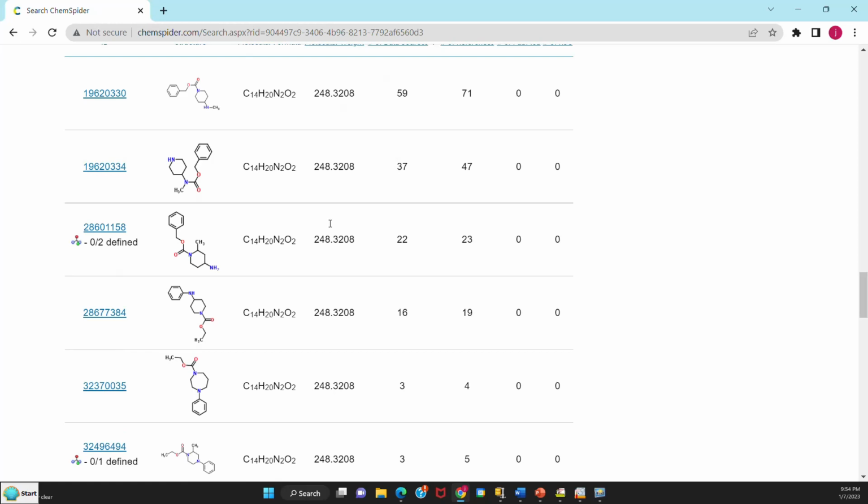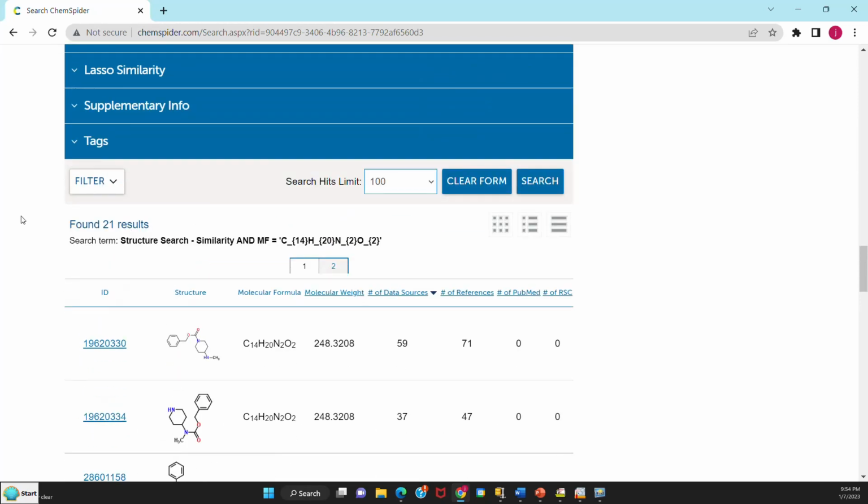So that's pretty much the end of my ChemSpider demonstration. And the main thing I need to say is you got to make sure that the right values get entered, make sure they're checked properly. Sometimes you need to toggle that window open and close to make sure the values entered properly. See that the search button is going around, which shows it's searching, and then look and make sure when you look at the results that what it did matched what you asked for.